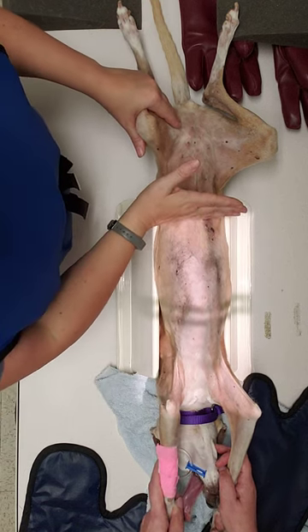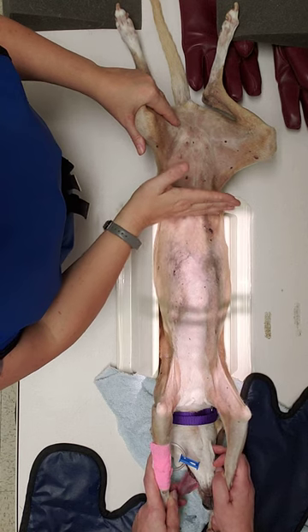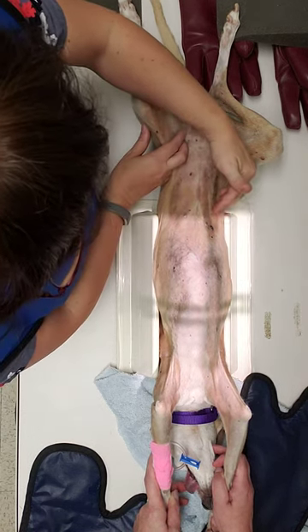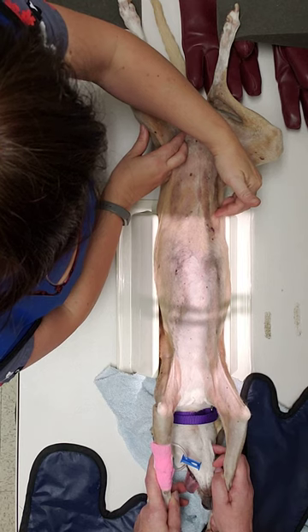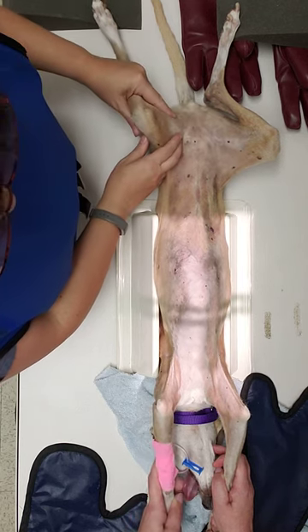Your caudal aspect of your light is going to be equal to the 13th rib, and that's very easy to feel. As you come down the side you can feel the caudal aspect of the 13th rib — the furthest point backwards.